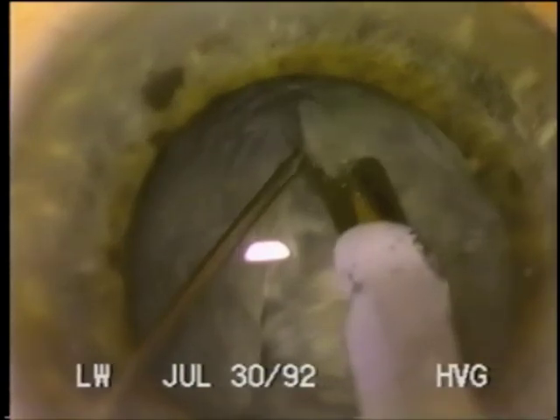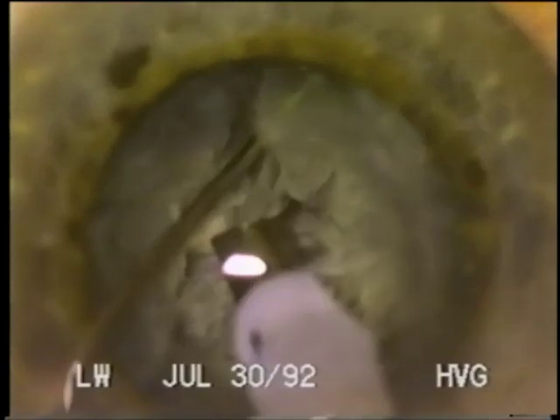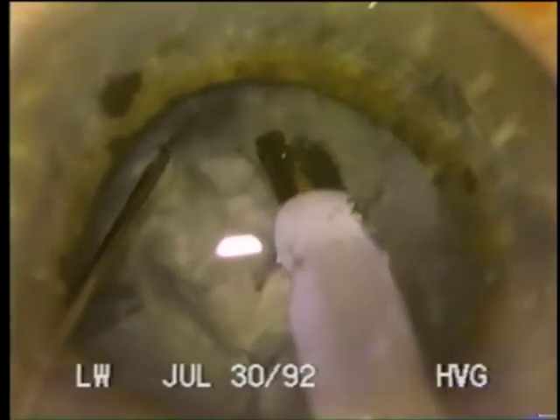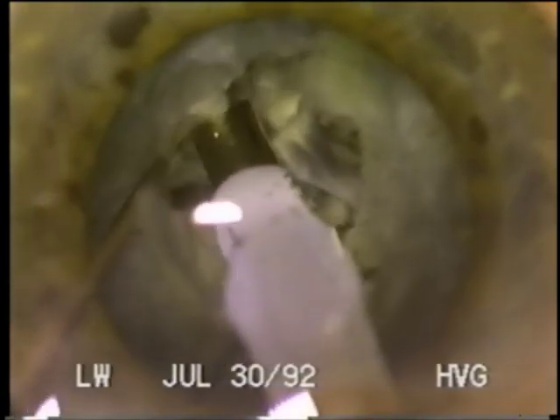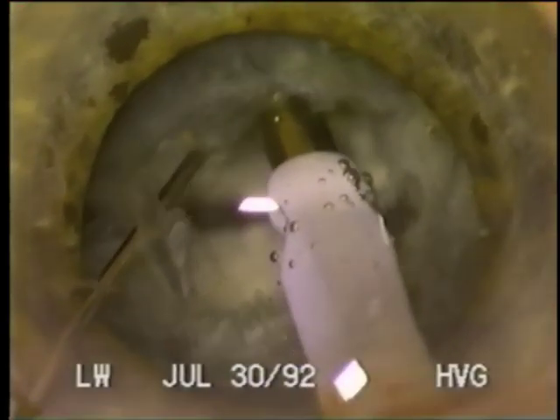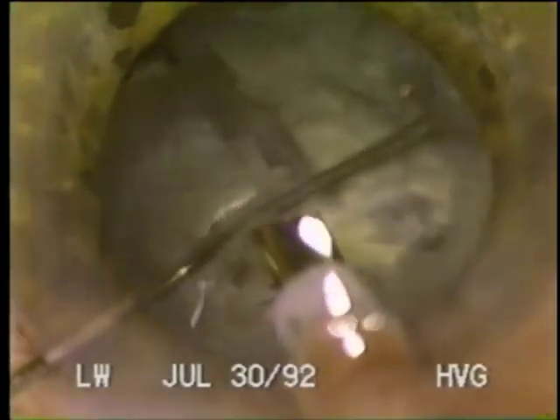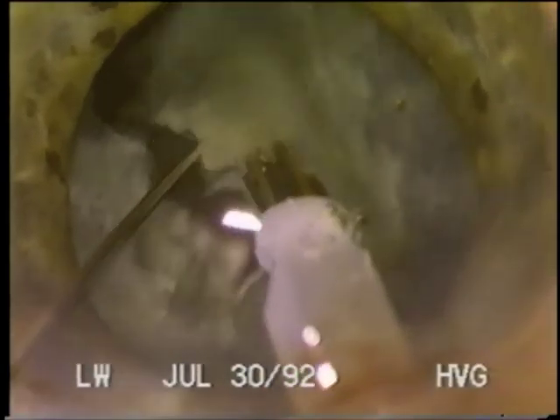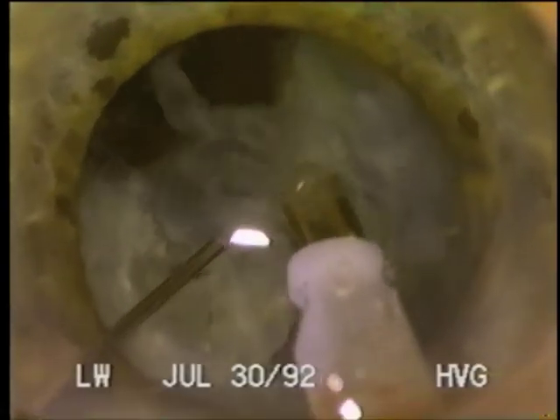In very dense, rubbery, brunescent lenses, it is desirable to debulk even more of the center of the lens before any fracture is made. Once the lens center is debulked, fracturing is initiated into the nuclear rim, dividing it into small, manageable segments. Because of the crater made before fracturing, we have used the term crater divide and conquer for this technique. In most dense cases, however I decide to fracture, I will leave the segments in the bag until all fractures are completed. This allows for greater stability during phacoemulsification, particularly at the end of fracturing the nucleus into segments.